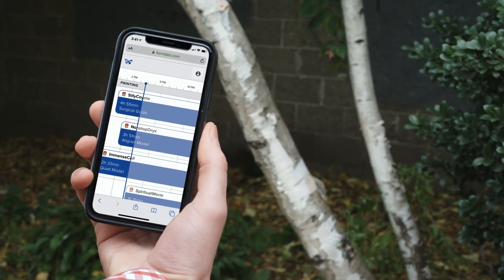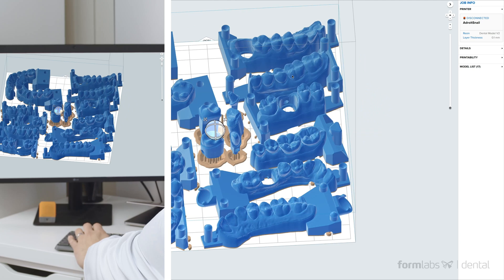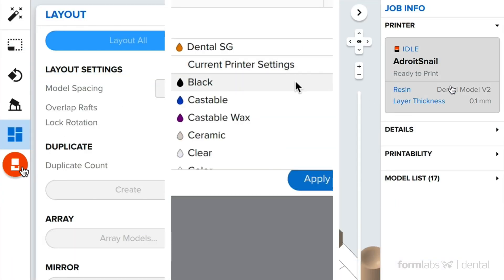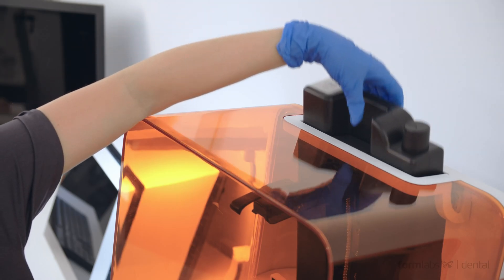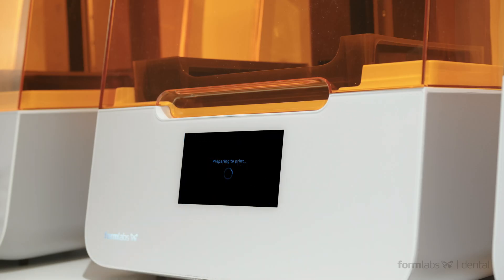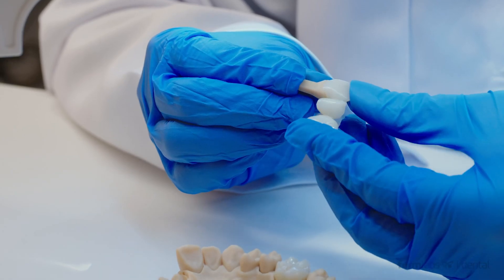Remote print allows you to initiate and monitor prints from anywhere. With user-friendly PreForm print preparation software that integrates seamlessly with existing imaging and CAD-CAM solutions, and full independent control over settings and materials. The Form 3B's large build platform and automatic resin dispensing material cartridges allow for more parts per print job. Dental labs can expect to see 55% less labor and costs compared to competitive 3D printers.